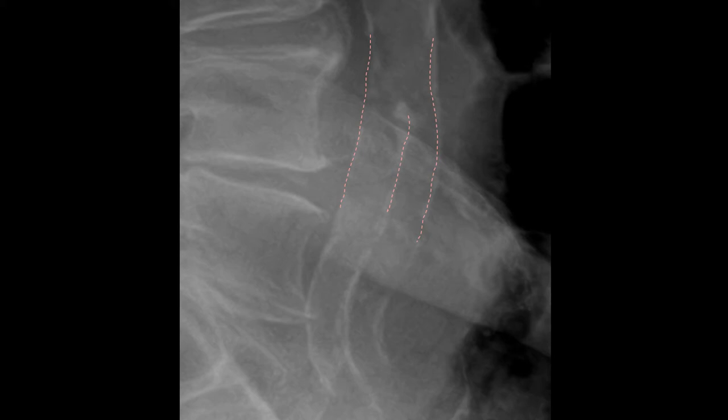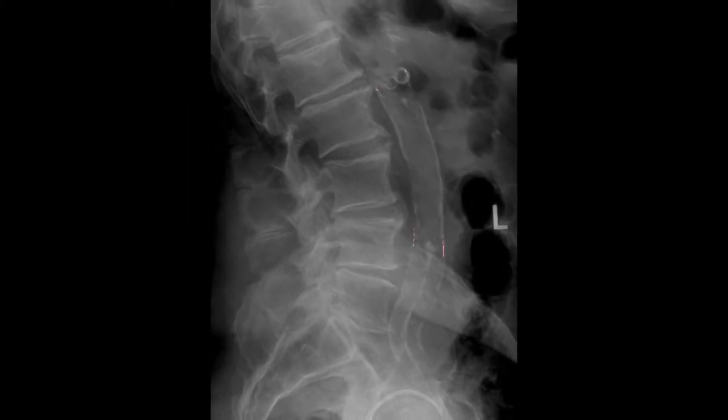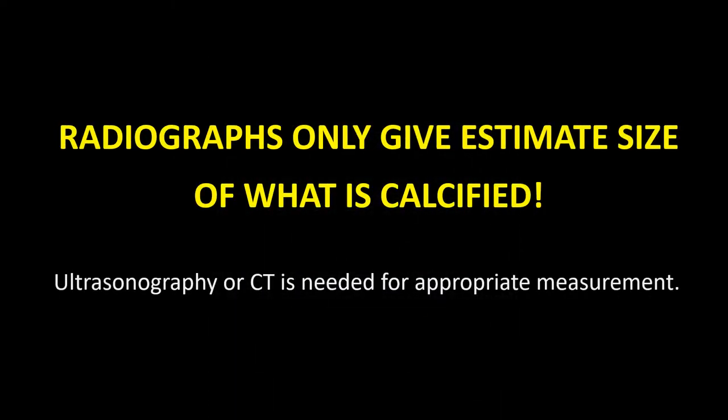We can see both the left and right common iliac arteries. The most common location to see an abdominal aortic aneurysm is infrarenal and superior to the bifurcation of the common iliac arteries. Remember, radiographs only give an estimate of the size of what is calcified.